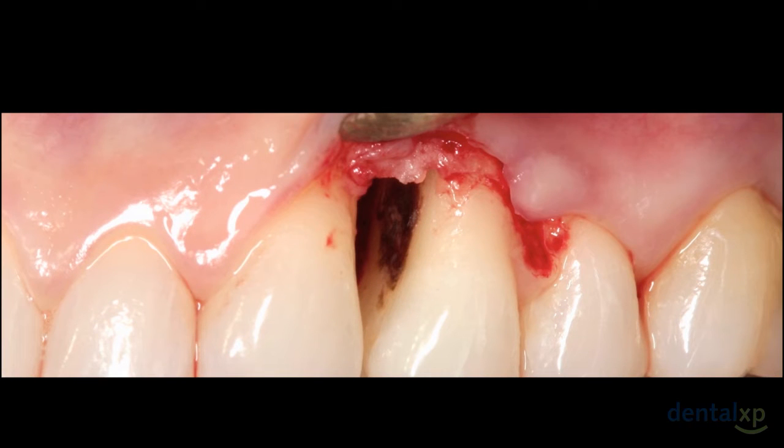This case presented to me several years ago. The patient was from California. He was referred to me with a large periodontal abscess on tooth number 12. I find treating bicuspids to be most difficult if I cannot gain vertical access. So in essence, in looking at the case, I think we would all agree that removing the calculus is critical, but if we could remove the concavity present, that would be even a better benefit.